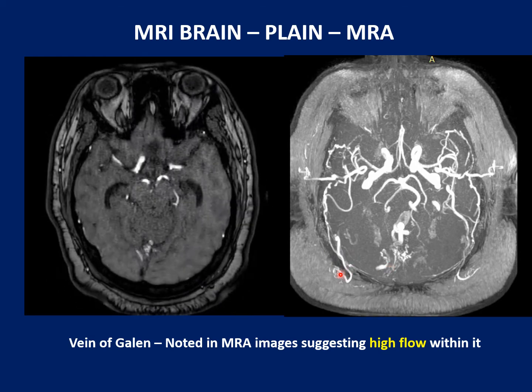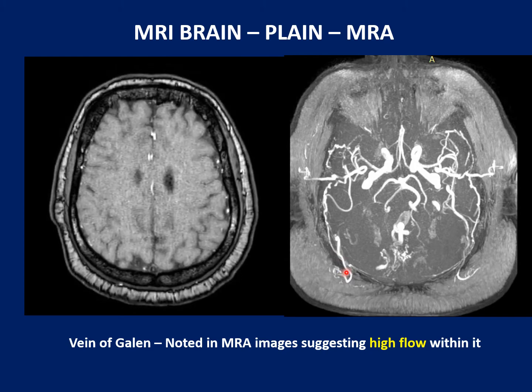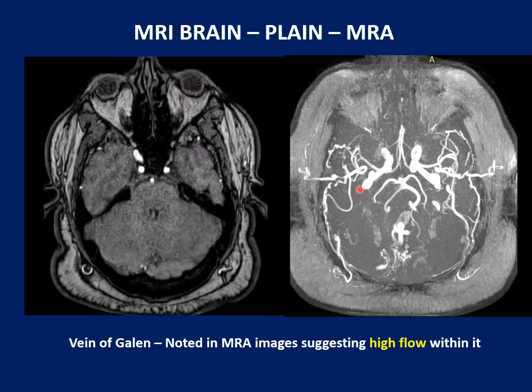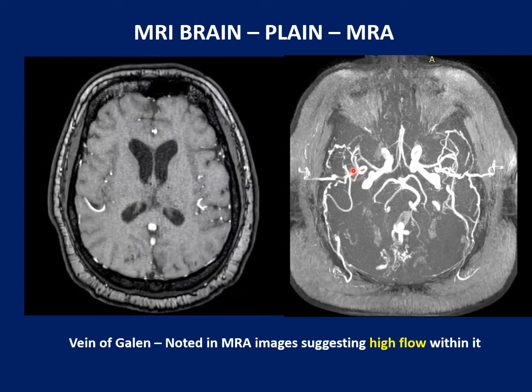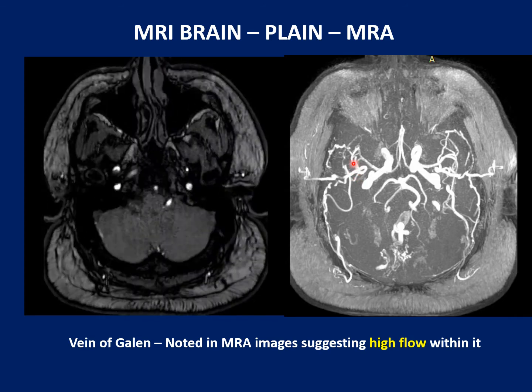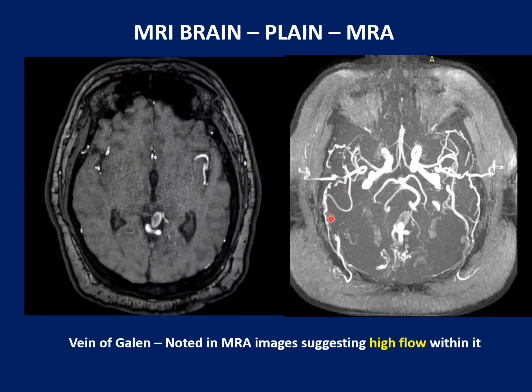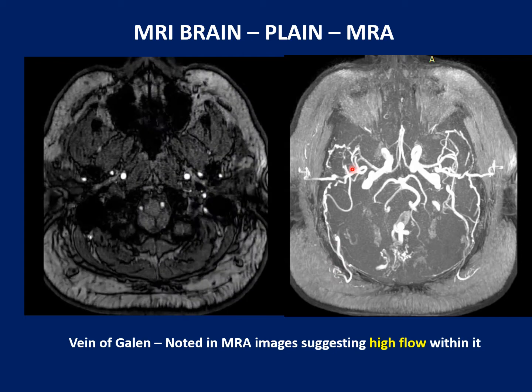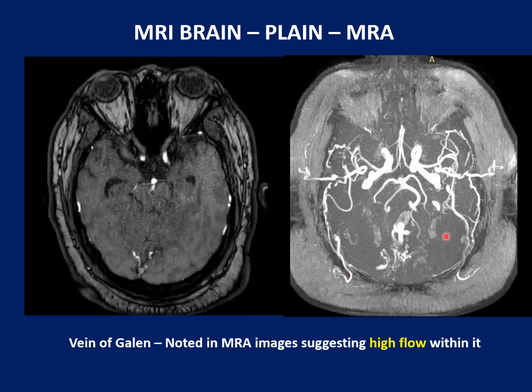However, here we are able to see this occipital artery, the mastoid branch, is actually a transosseous branch. It is going through the skull and entering. Whereas when the middle meningeal artery enters into the skull, it enters through a foramen, that is the foramen spinosum. So it is easier for the microcatheter as well as for ONYX to be injected through this longer path rather than the shorter path because of the foramen spinosum. These are called the transosseous feeders into the fistula.